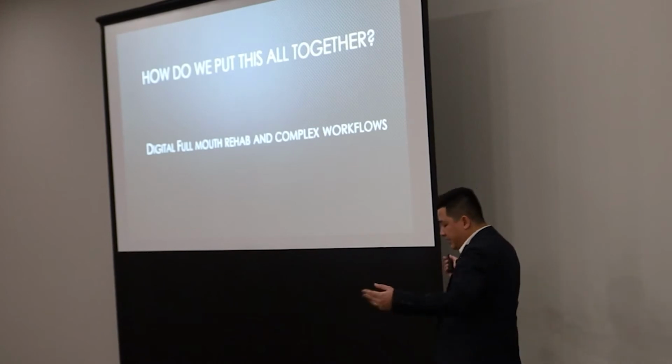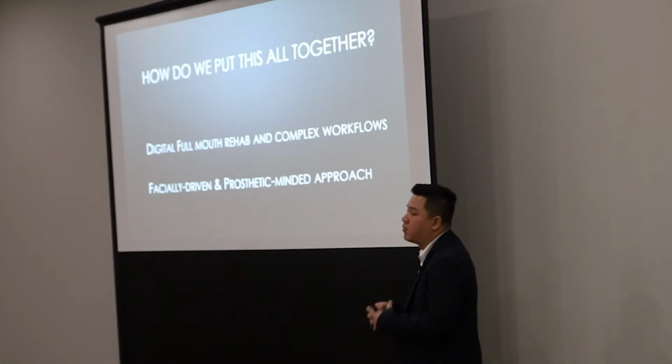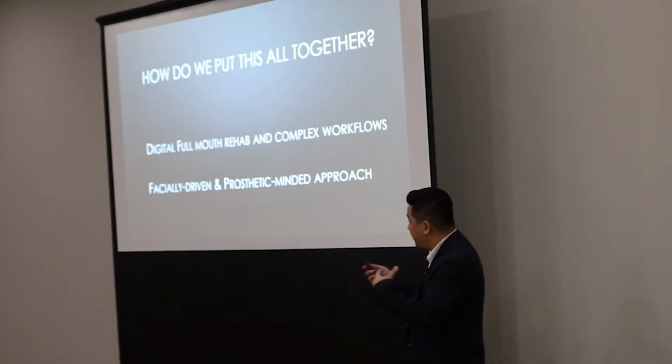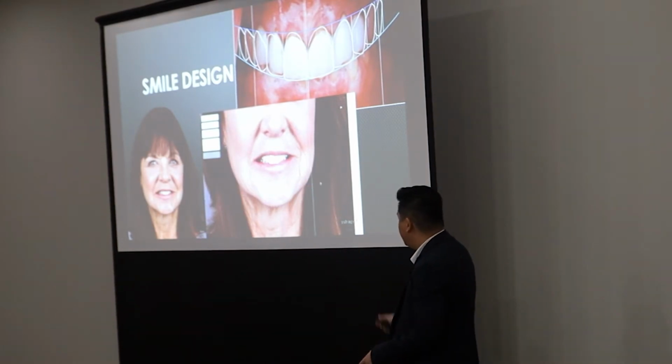So how do we put this all together to make digital full mouth complex cases and rehabs using 3Shape? Well, I always like to take a facially driven, prosthetic minded approach whenever working with anything, especially for these complex cases. So if you saw my presentation earlier today, then you would have seen this case. This is Jenny. We did a full mouth rehab for her.